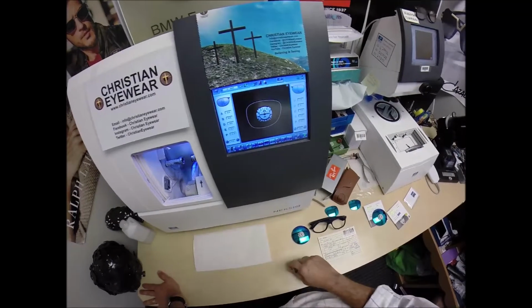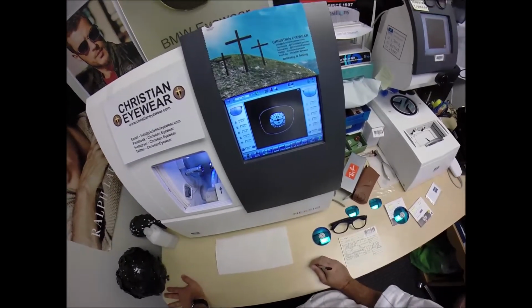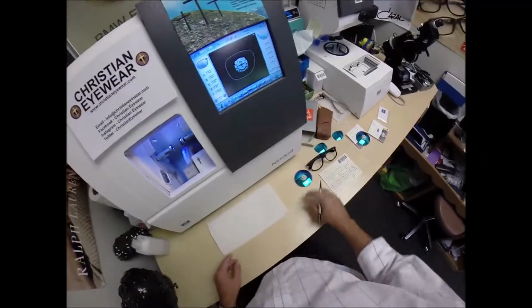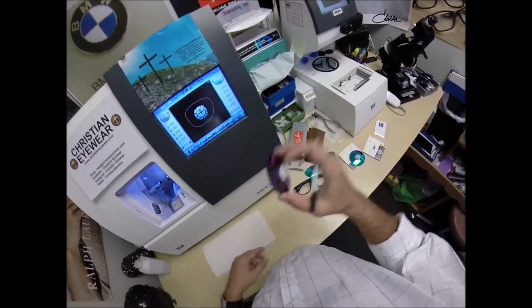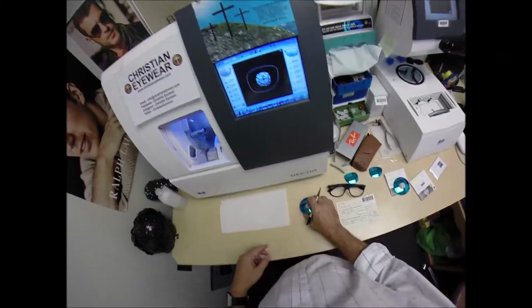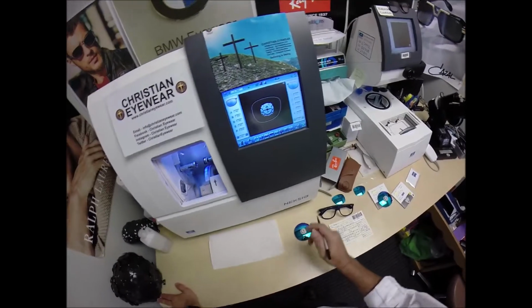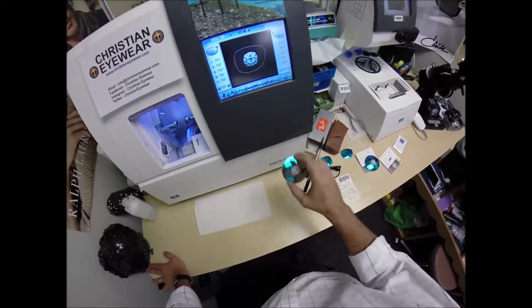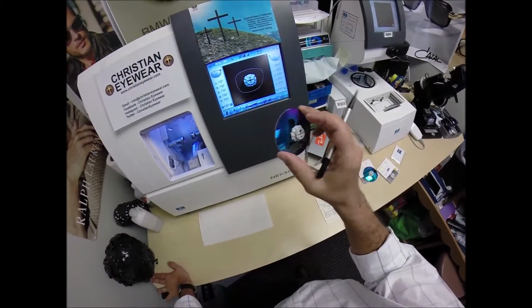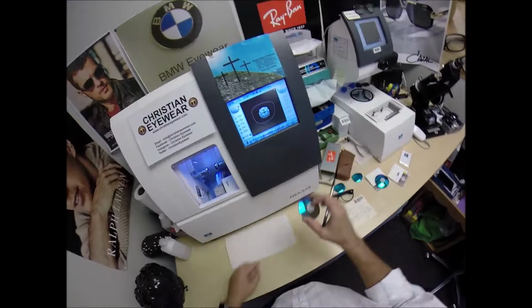I'm not going to polish the edge of the lenses because I would never do that for sunglass lenses. Rarely, if ever, do I do it for clear lenses. I don't want any glare. When you polish the edge of lenses, glare comes in. Now, there are certain drill mount frames that you can twist my arm and get me to do it. But other than that, nobody gets polished lenses because you're paying to have stop the glare from coming in. Why would you let it on the front and the back of the lens? Why would you let it in through the side?